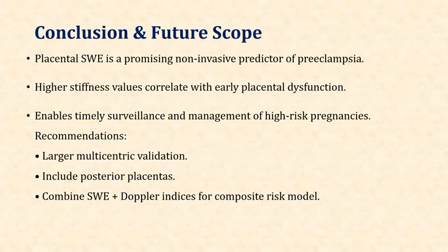High stiffness values correlate with early placental dysfunction, enabling timely surveillance and management of high-risk pregnancies. Recommendations are large multicentric validation, include posterior placentas, combining shear wave elastography along with Doppler indices for composite risk model.